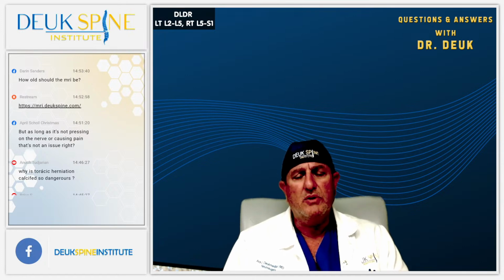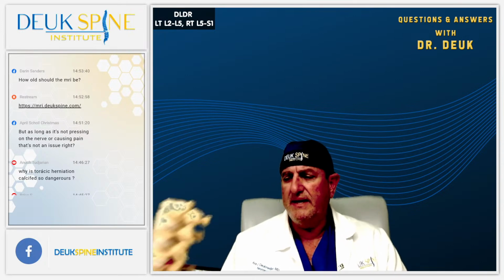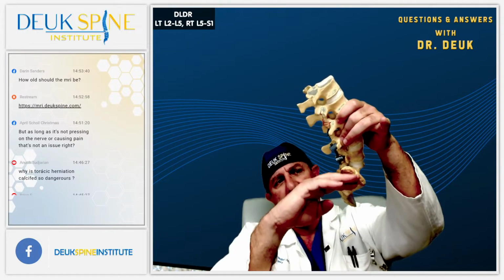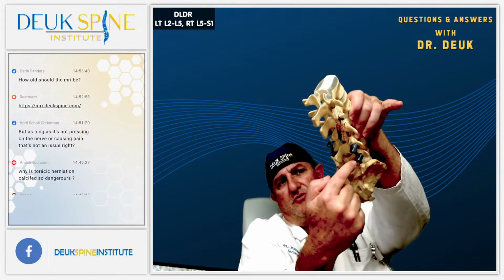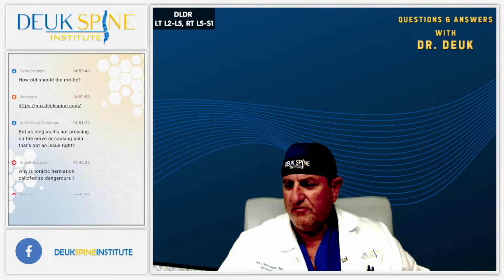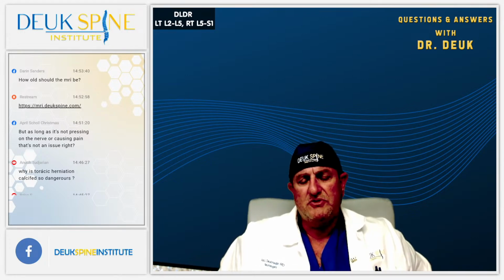We didn't have any complications. The hardest area to get into was that L5-S1. I had to go through this, and there's actually another bone right here. You can't even see it. It looks like this. It's called the iliac crest. And I had to work through this tiny little space there to get into the disc from the side. So hopefully you can appreciate that. It went well. Got everything done. I think the patient will do fantastic.